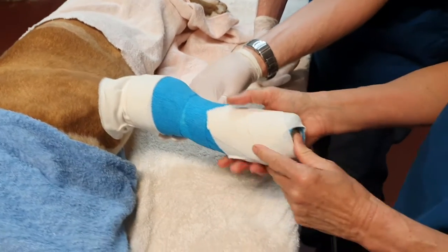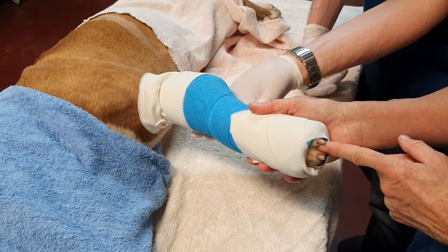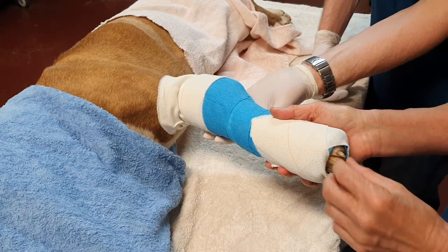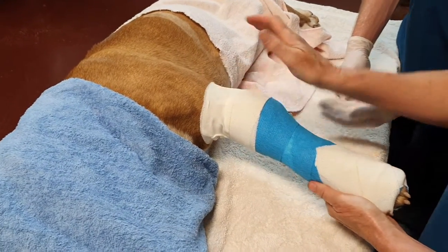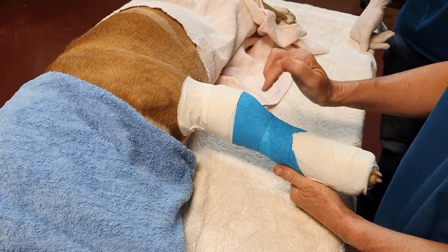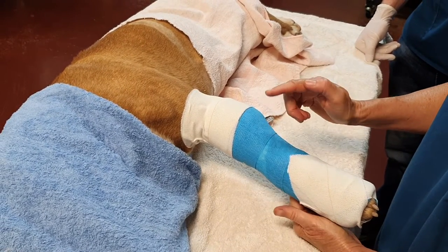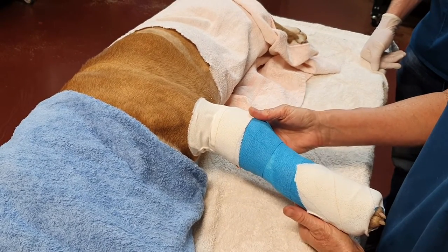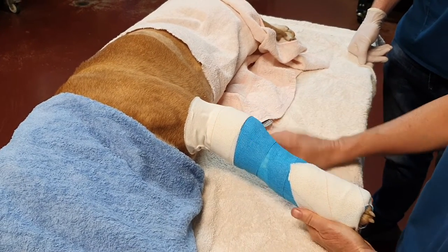We can still see our toes — I don't like covering them up. I keep repeating myself but I do like to be able to see them. Some people argue that dirt and crud gets in there, but at least it's closer to the ground and can fall out. If an animal is really uncomfortable in this, if it really starts to chew and gnaw at it, we're very quick to blame the animal as being non-compliant, but it's normally because they've got a pressure sore underneath. So don't ignore the animal if it's really annoyed and chewing at the cast, or if you see an offensive smell — get it off, have a look at what's going on underneath. It probably means you've got a pressure sore. And that's the lateral splint.